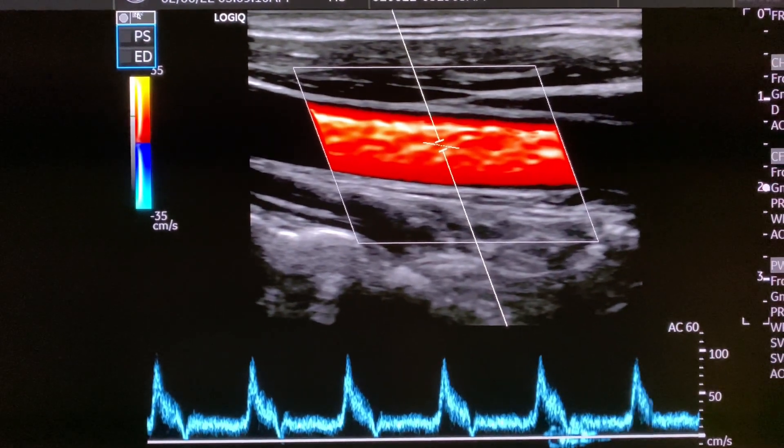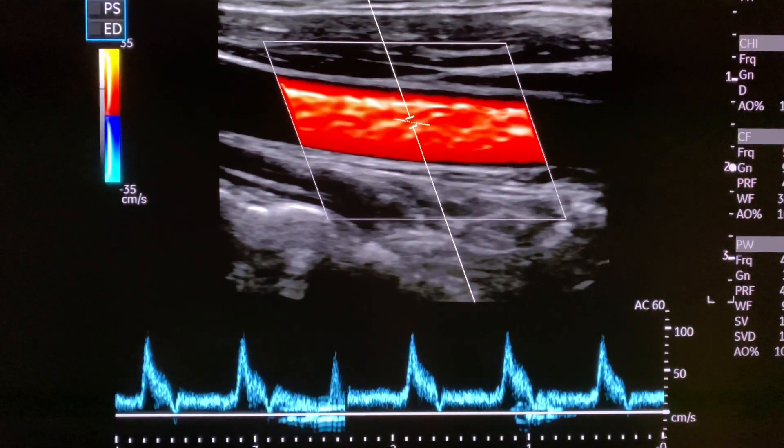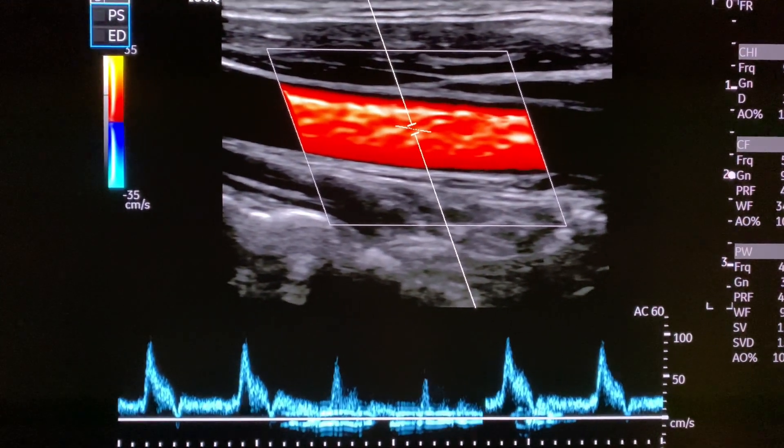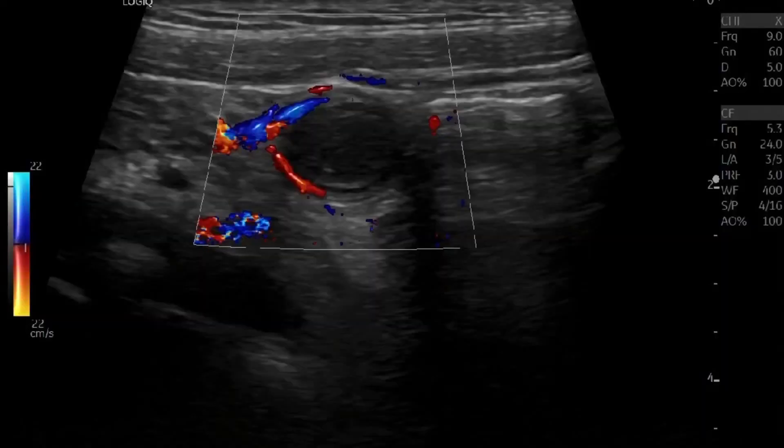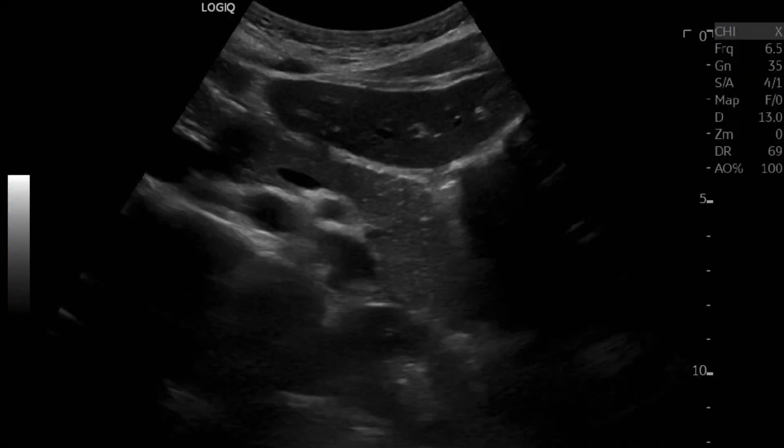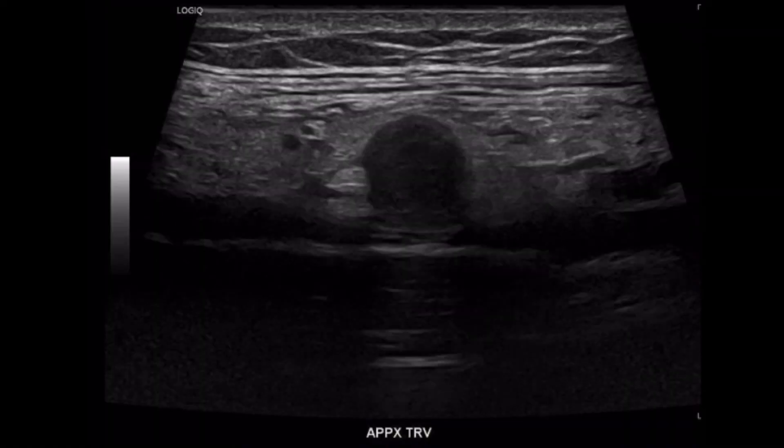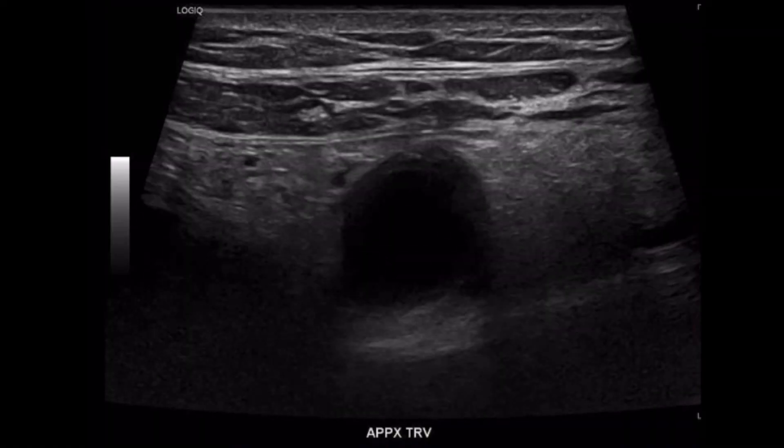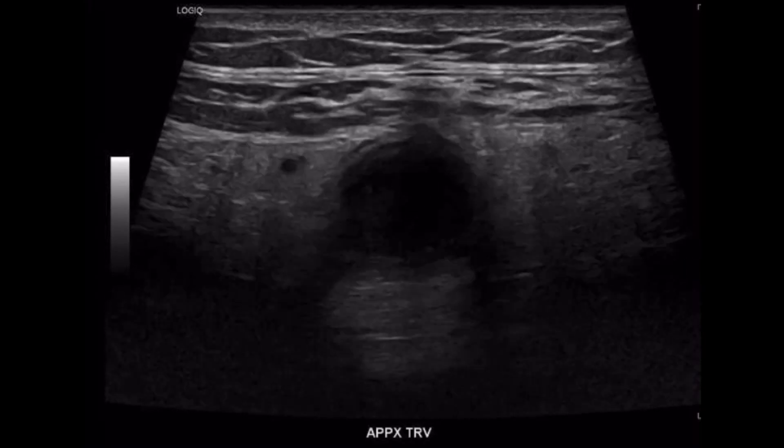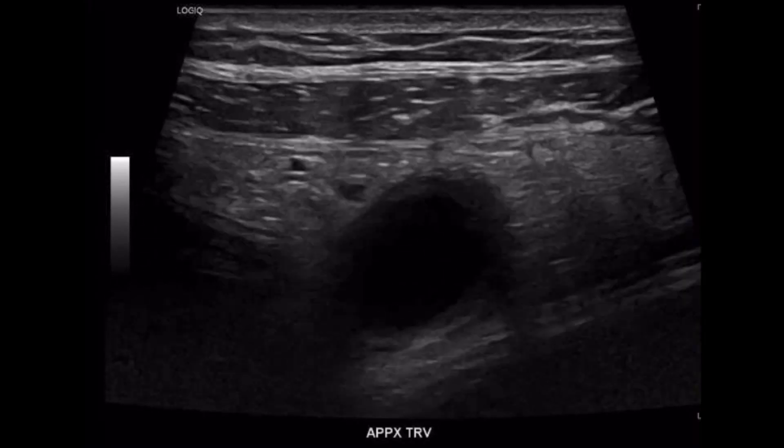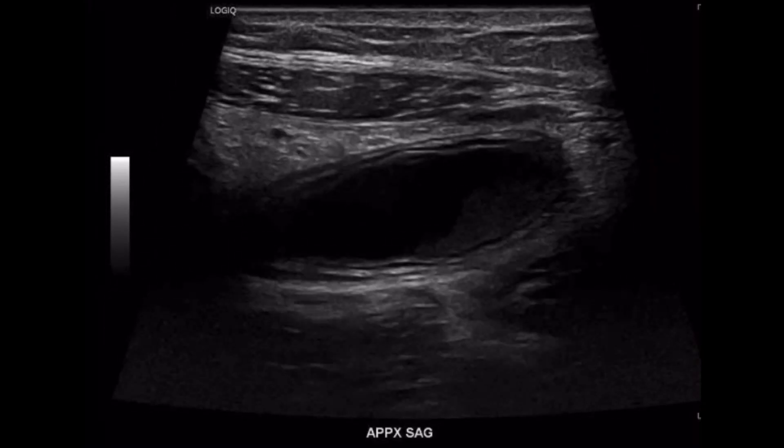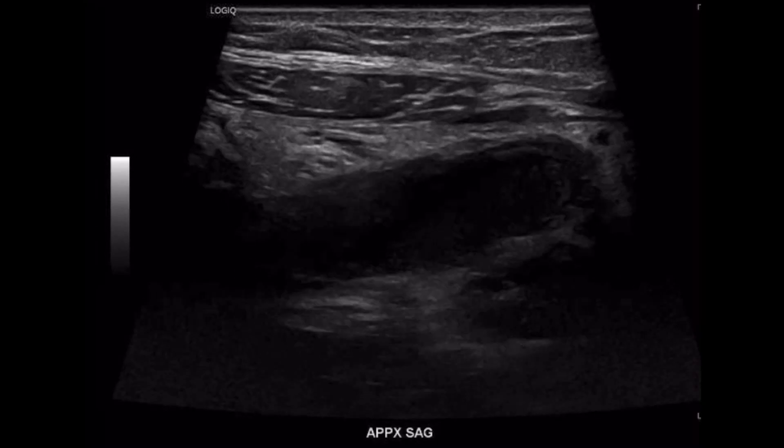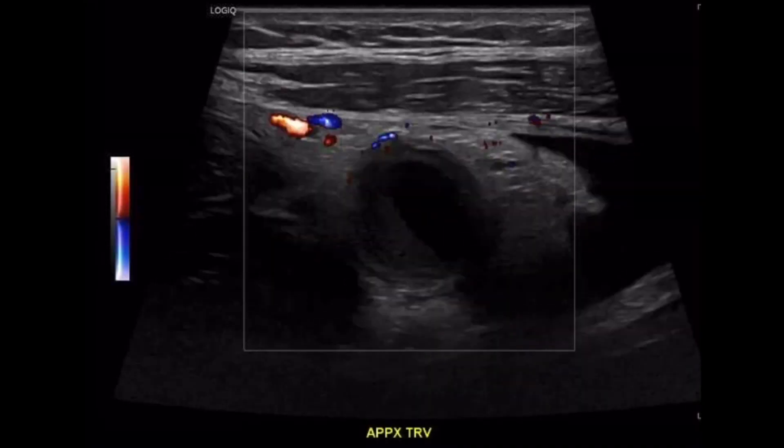All right, now let's look at some cases. This is an appendix in transverse with a nine megahertz transducer. You can see the image is extremely clear. It's measuring about 1.5 centimeters. This is with the radiant flow, look how pretty. And this is sagittal, look how clear you can see the gut signature. And here's a pancreas in transverse, look at that how clear. And this is another appendix with the L22 megahertz transducer, not in a baby at all. And this is just amazing. This is sagittal, look how you can see the layers of the wall. You can see the debris inside the gallbladder, and that's free fluid there.